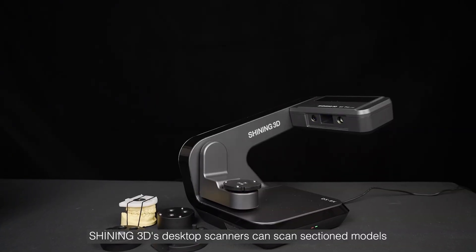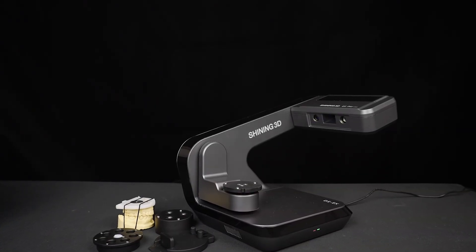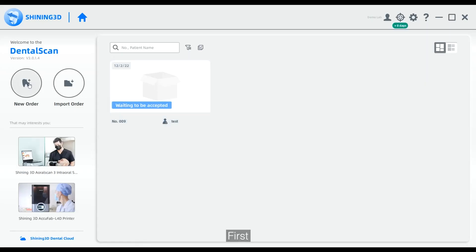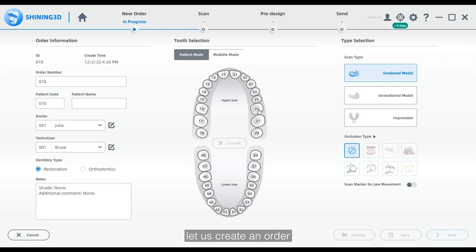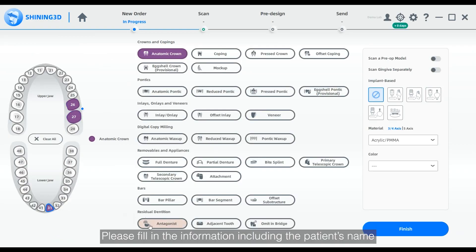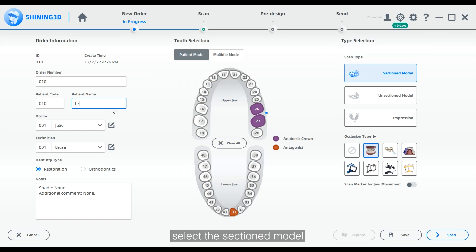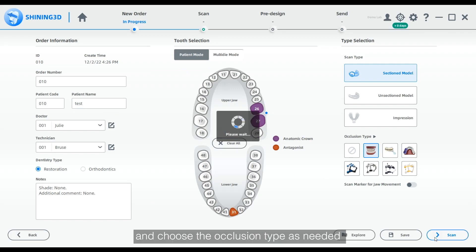Shining 3D's desktop scanners can scan sectioned models. First, let us create an order. Please fill in the information including the patient's name, select the sectioned model, and choose the occlusion type as needed.